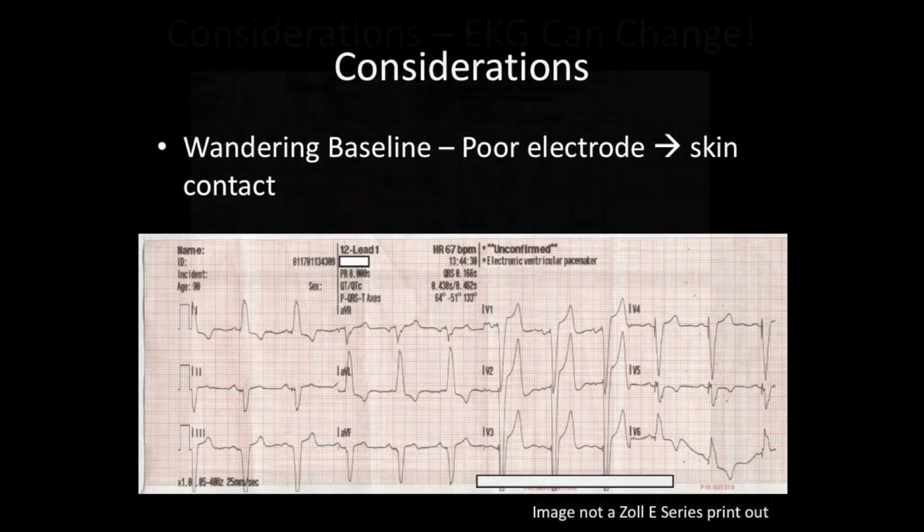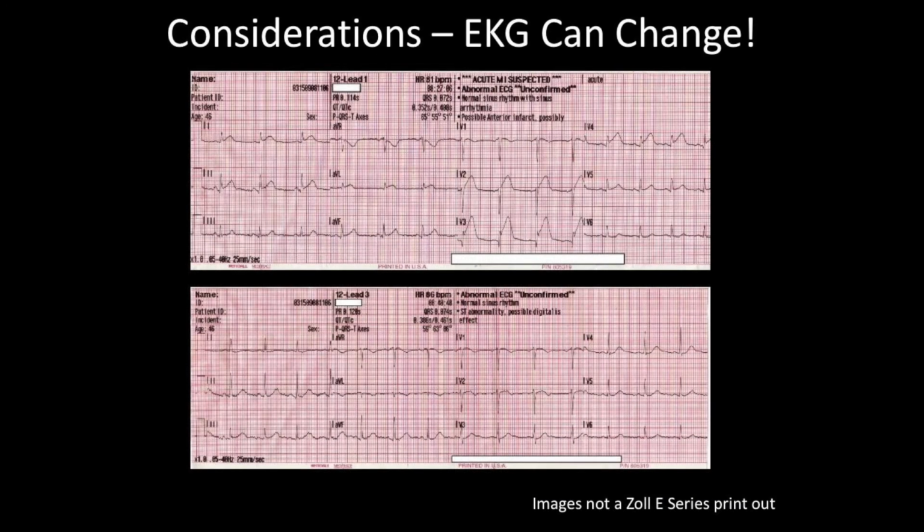Okay, so this is to talk about how an EKG can change, right? So this is the same patient. Does it look the same? No. Up here, you have the fireman's hat, right? This is not as clear. This is probably your best picture of that. So this is ST elevation in 2, 3, 4, not really, and 5. So again, anterior, a little bit lateral MI, right? In the first one, what is this? No, right? Except then you can start talking, oh, it gets more complicated, never mind. So it can change, right? That's all you need to have in the back of your mind.